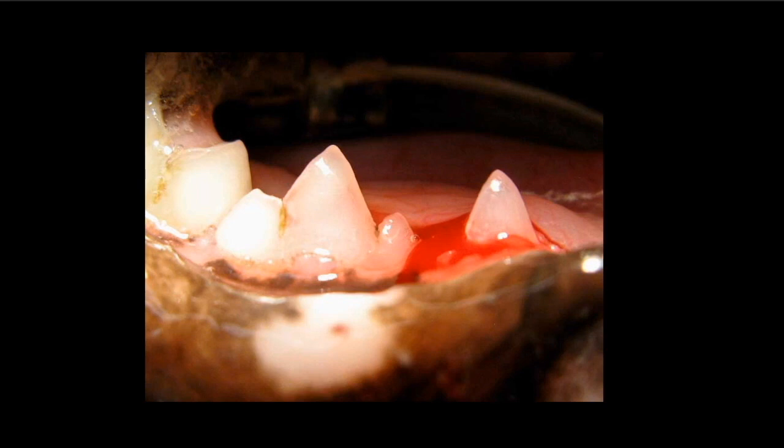Moving on, let's talk briefly about something else that's really, really common as a case example, and that is tooth resorption in cats. So we've got this image. Take a look at that. Look at those two teeth that you can see. There's obvious changes there with the bleeding on that third premolar, the one on the right side. The fourth premolar, you have to look really close to see the changes on that. But take a look at that, see what you think, and then I'm going to show you the radiograph.